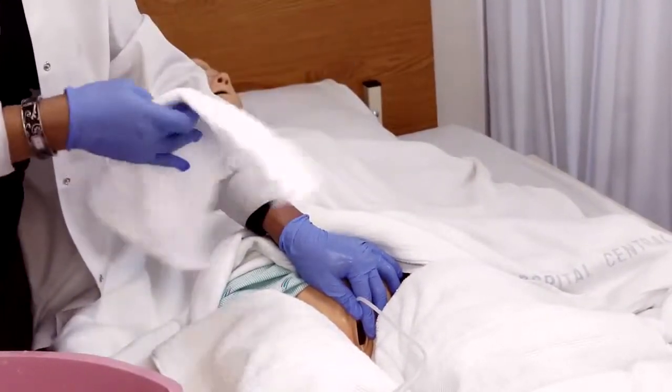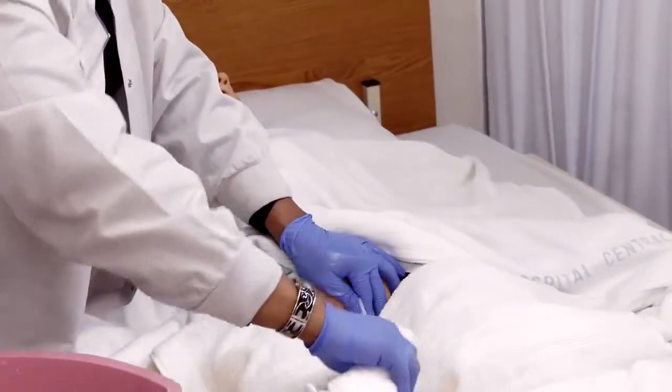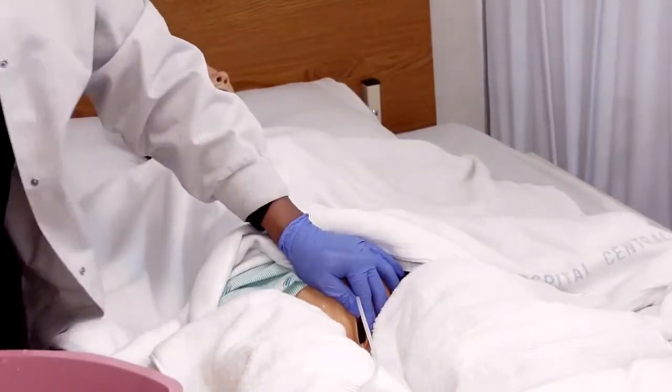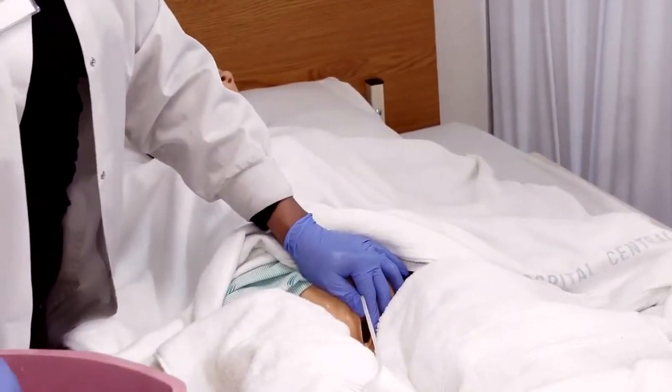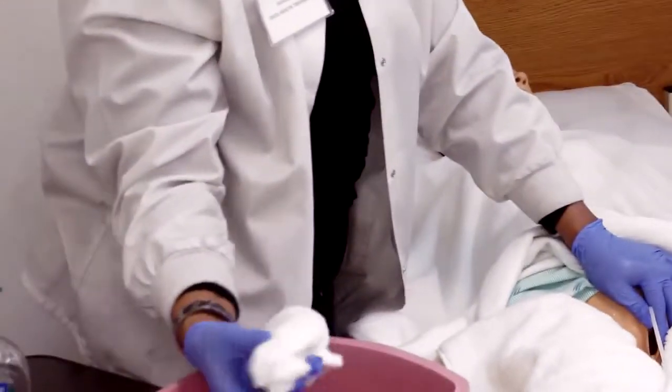Still holding onto the catheter. You do not let it go and do not shake the washcloth. We wash down 4 inches again. We put that in the laundry. And then we rinse. At this point, you're doing everything with one hand. So you hold onto that catheter.